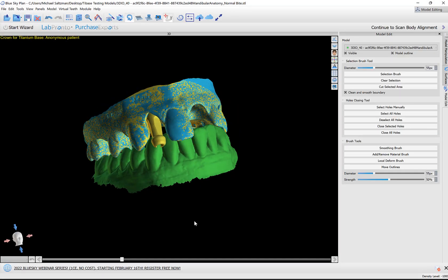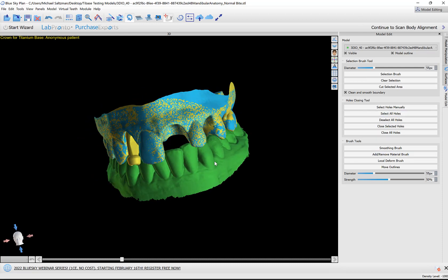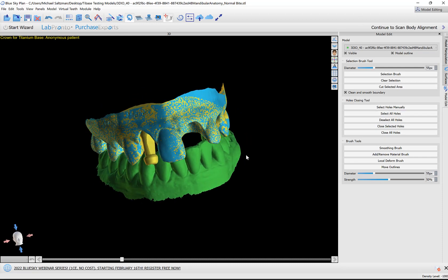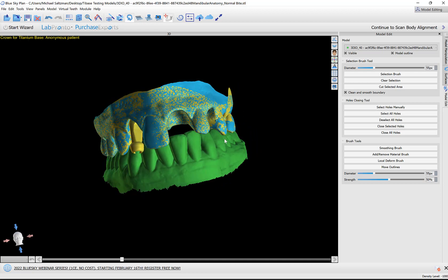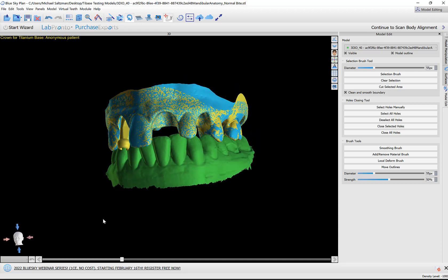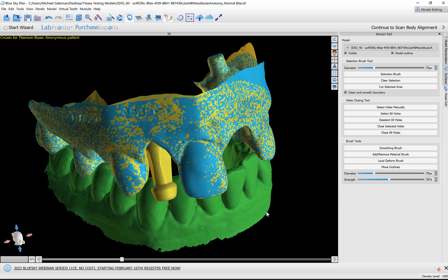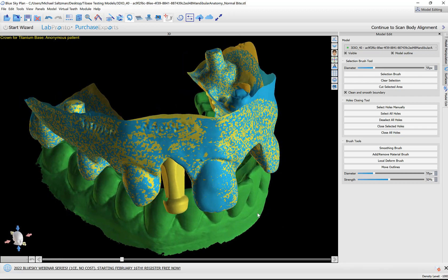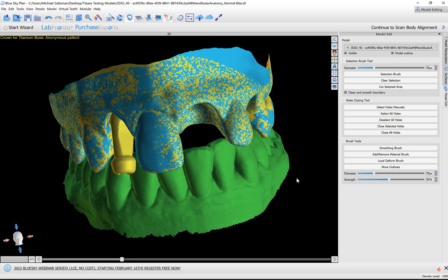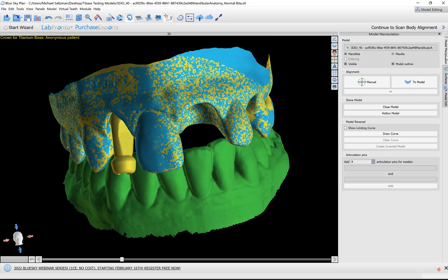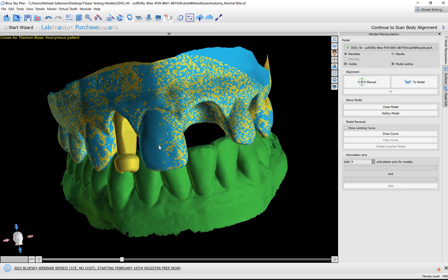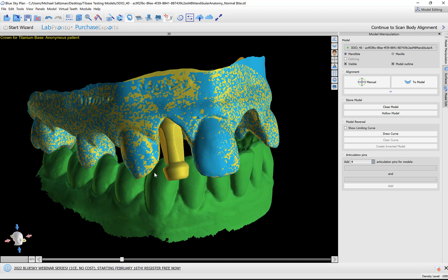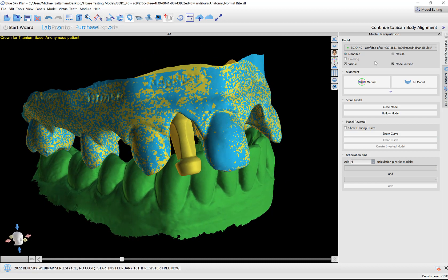Our model editing panel is now visible on the screen. We can see the models have been imported and are oriented to the head on the bottom left. If we wanted to close our models or close and hollow them, or any additional functionality we have here, we could do so. We have model manipulation as well that allows us to add articulation pins. We're going to proceed with aligning the scan body.